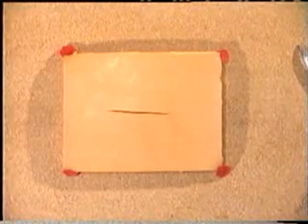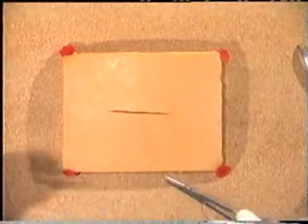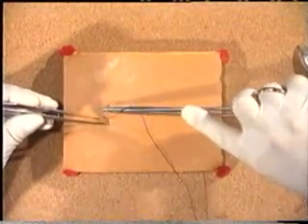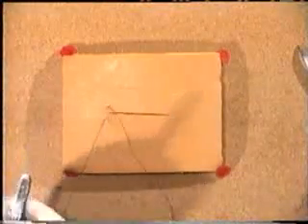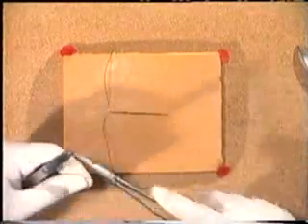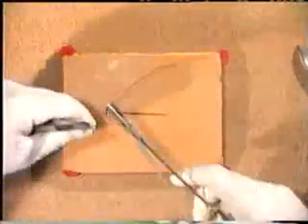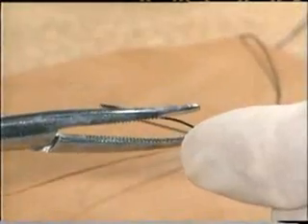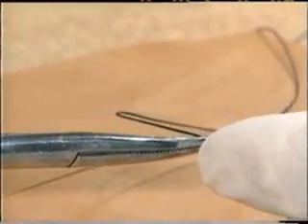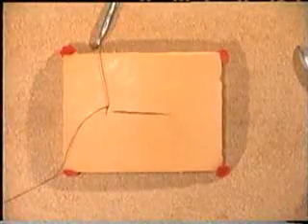We will now demonstrate the essential role of the assistant in the insertion of a continuous suture. Start once again by inserting the initial suture and ligating this using the reef knot technique. In this situation, let us assume that we wish to maintain a hold of the end of the short suture as a stay. In this case, get your assistant to place a hemostat on the end of the suture, grasping it right at the tip of the jaws, not up near the hinge where it would slip. Grasp it in the tip of the jaws and place to one side.